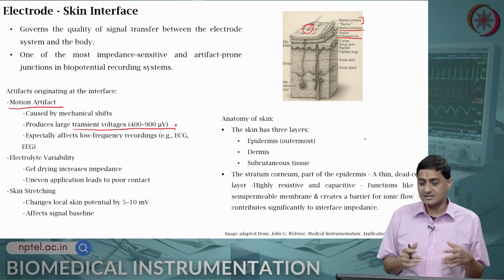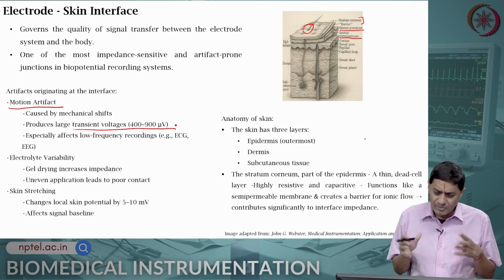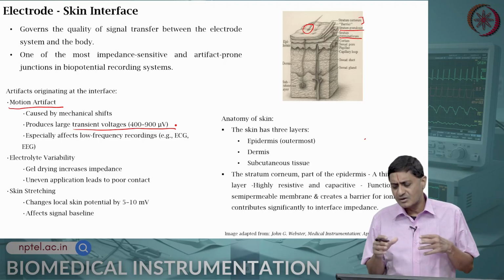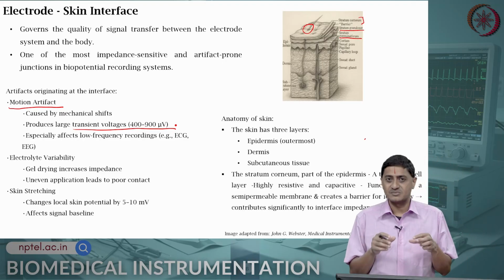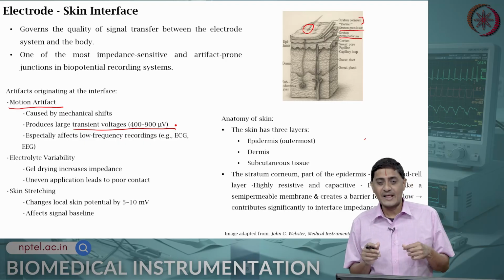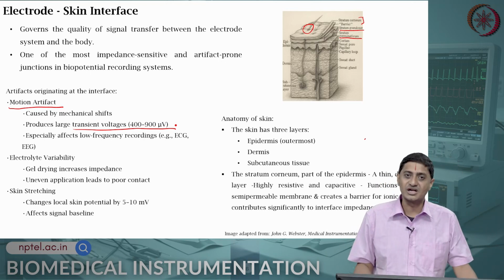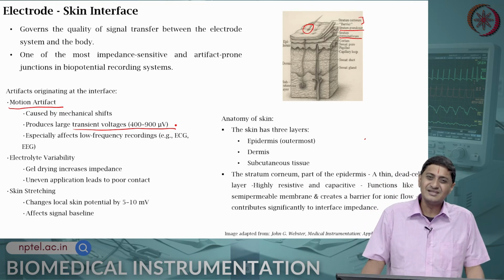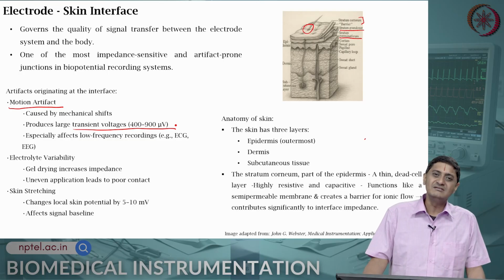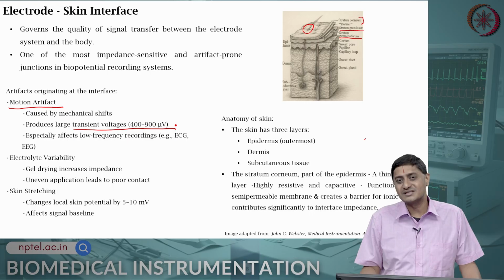Another problem is that a simple way to get rid of movement artifact may be to think that, well, movement artifact does not happen very fast, it is a relatively slow process. So, it is a low frequency signal. So, you could for example use a high pass filter and get rid of the movement artifact, except this will not work in signals that have significant signal power at low frequencies.